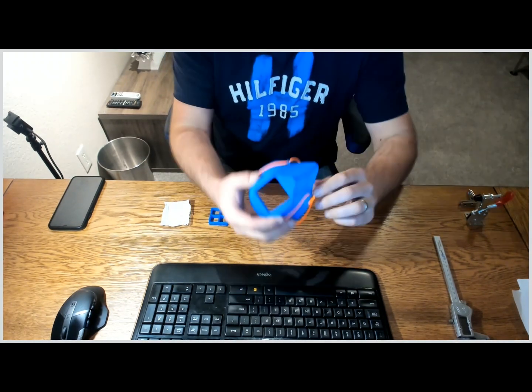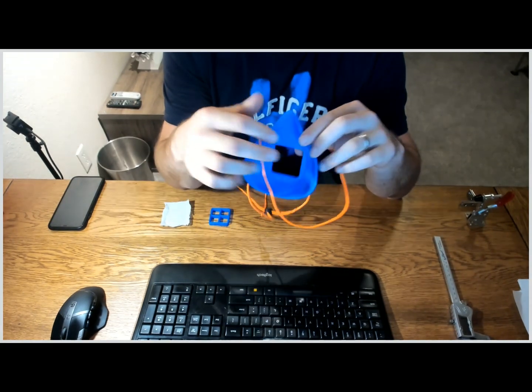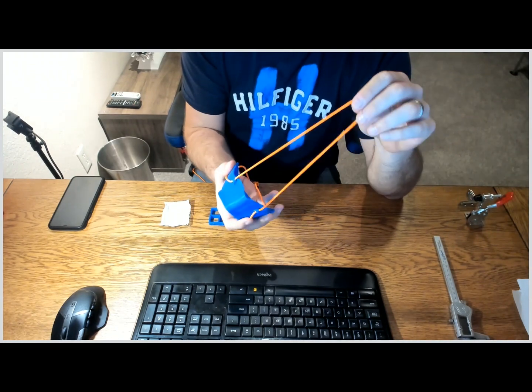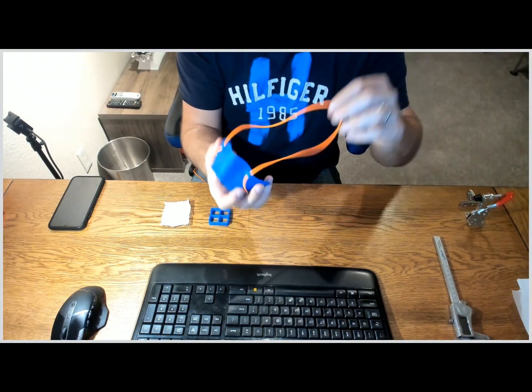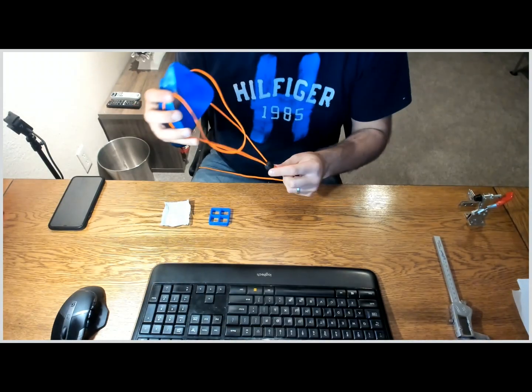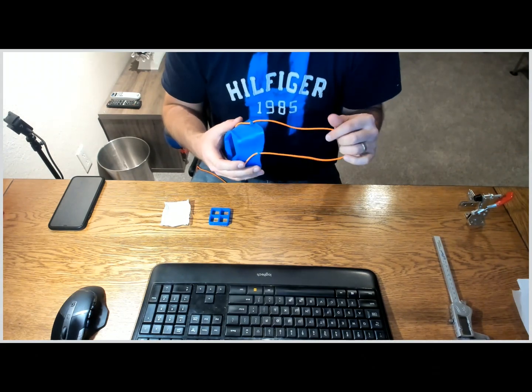So the mask looks like this — pretty straightforward design. It's got the mask itself, dimensioned for your face. I routed some elastic cord through there so the head would go through here and here. I have a few of these push-button things and I've managed to source about a thousand feet of this cable, so I'll make as many of these things as I can.